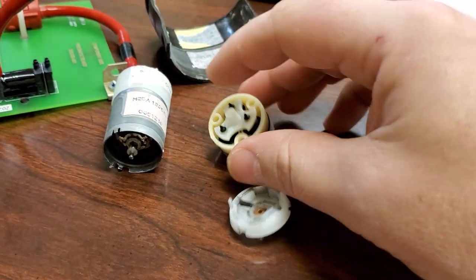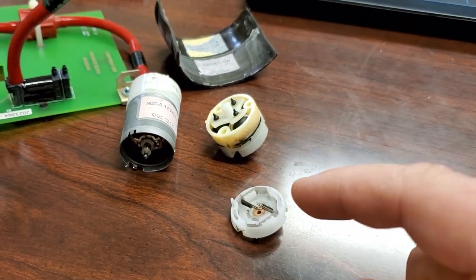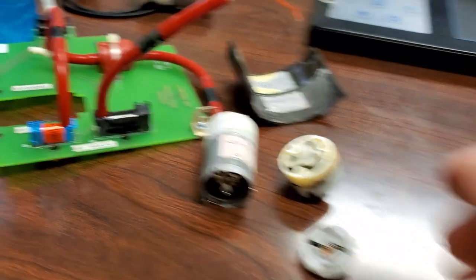There's no real lubrication. So the problem is, eventually it's going to cause more wear on the motor. It's a limited lifespan motor anyway because it is a brushed motor, so eventually it's going to burn out.